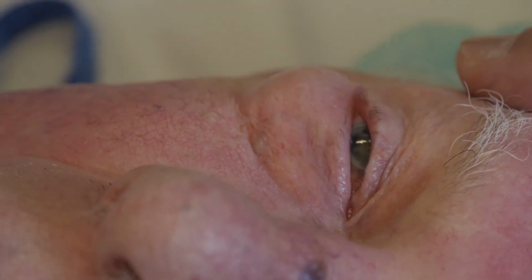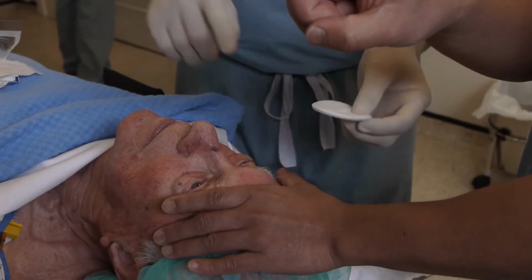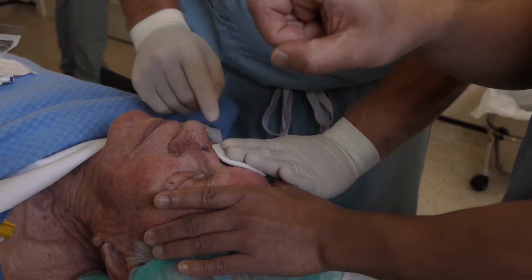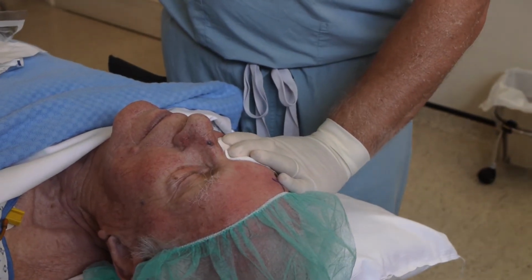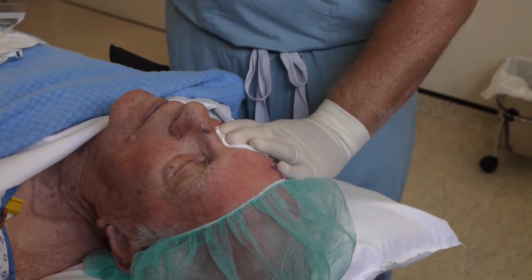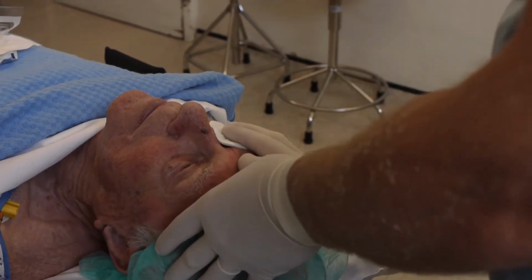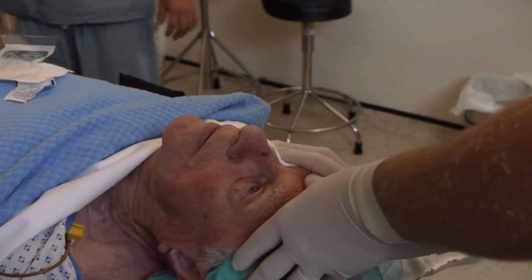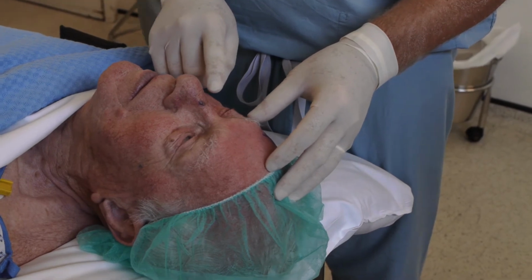And withdraw the needle. There's no blood in the needle, as you can see. Very avascular injection. And the patient is asked to gently close his eyes and firm pressure is applied. It's often a little bit uncomfortable for the patients at this point as the local starts to act. And you maintain digital pressure for about 60 to 90 seconds and reassure the patient at the same time, monitoring the vital signs. So here we are at 60 seconds.